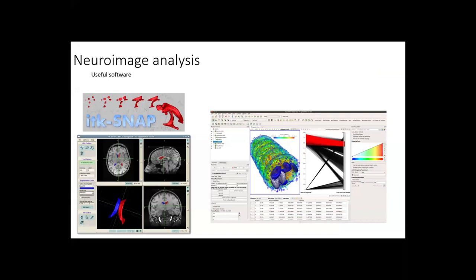We're going to show you how to display the image. ITK-SNAP is one of the tools that we widely use in the field. You can just load your image and see it in 3 views, and you can slide up and down, left or right. We have one example MR image, and she will show you how to install the software on your computer. It's free software, and how to display the MR image on the computer.